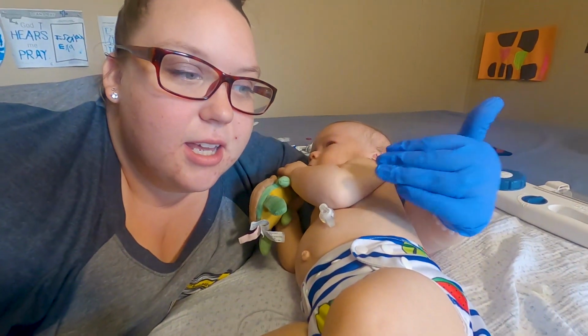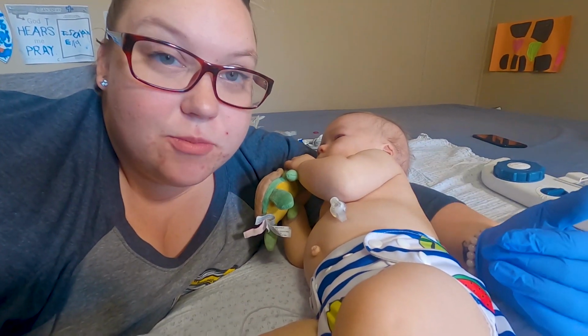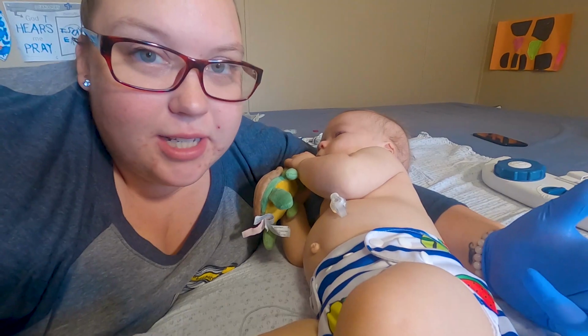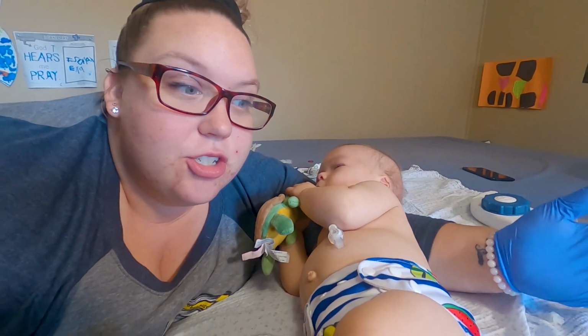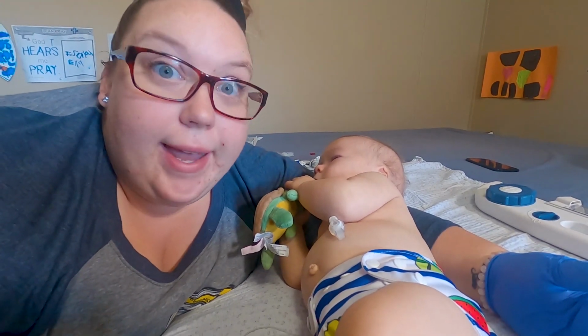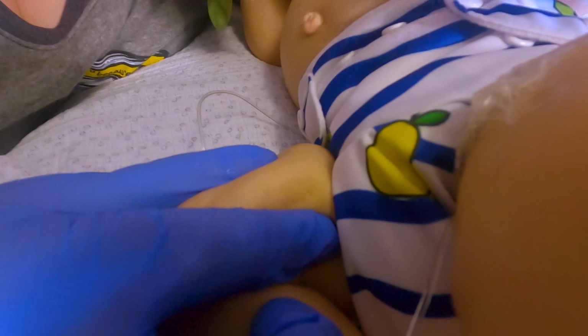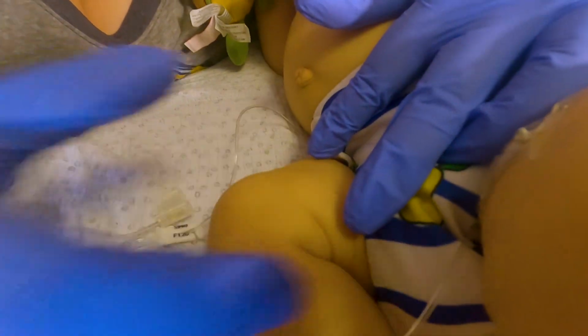Make sure you don't wave your hand over it like this. I know that is totally just human habit to do that, but that spreads germs over it. And they will teach you, anytime you learn how to do infusions, do not air over it to make it dry faster. Just wait. Okay, so it looks like it's pretty dry.